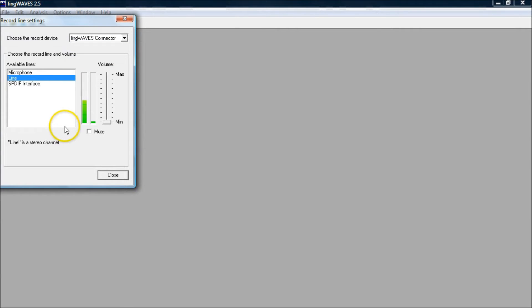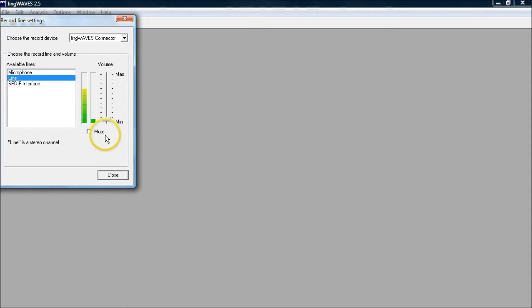Say 'ah.' You want to make sure it registers, but you don't want it to go into the red. If it's too loud, adjust accordingly.